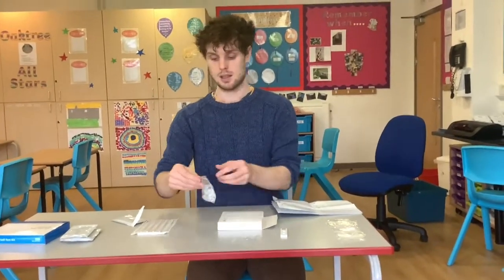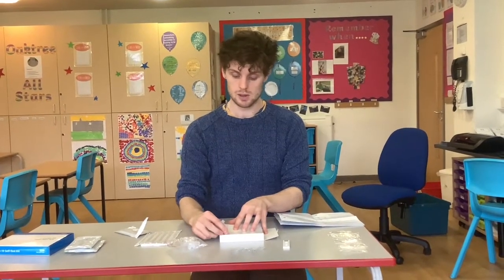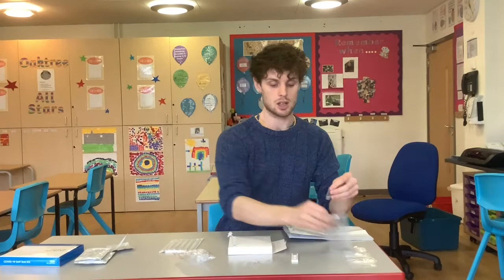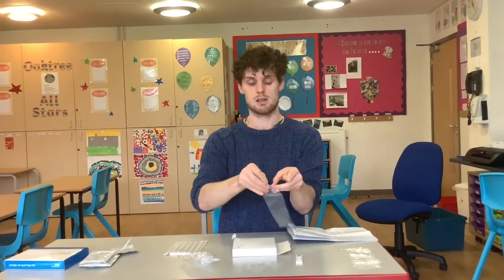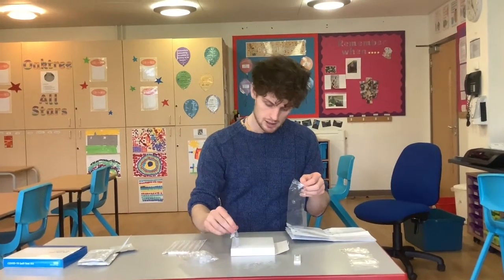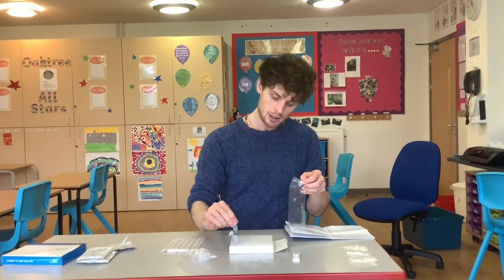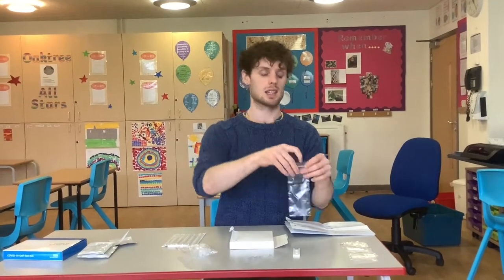Then you want to set up your box next to your test, pop a test tube into the hole so it's standing up, and then take some testing fluid. Screw the top off, discard that top into your clear waste disposal bag, and then empty the contents of the testing fluid into the test tube. Pop that empty sachet into the cleaning bag as well.